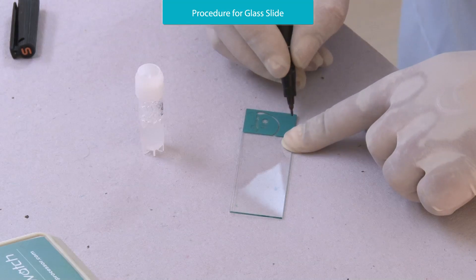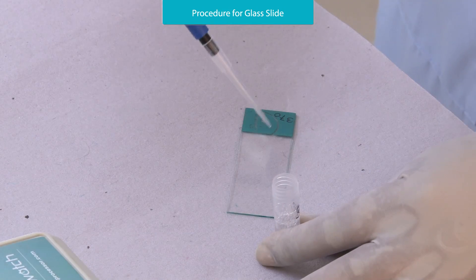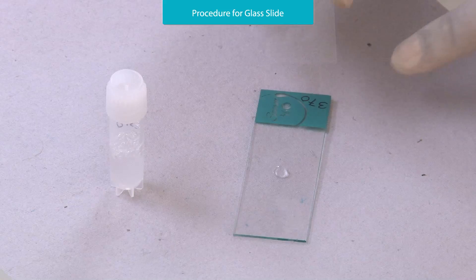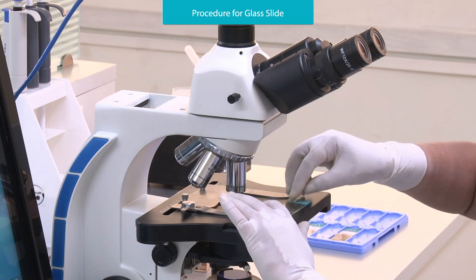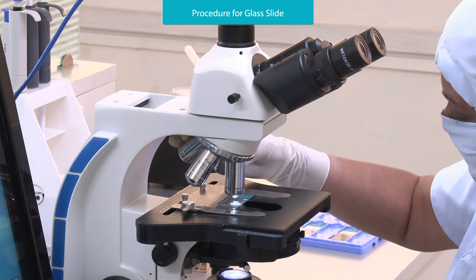Label the glass slide with ID. Place 10 microliters of the mixture on the glass slide and put a cover slip on the slide. Observe under the microscope using a 40x objective lens.